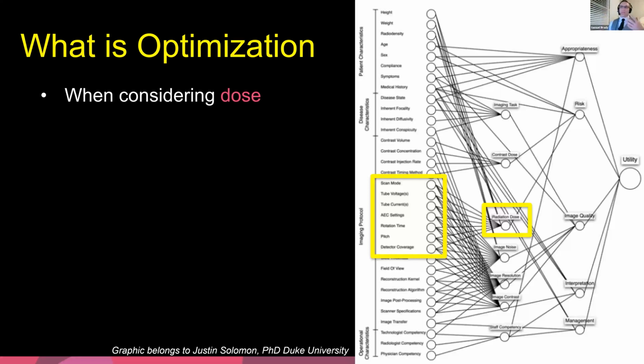So we had a lot of problems with our C spines for a long time. And the biggest fix, we tried everything. We tried kVs, we tried higher mAs, we tried everything. The biggest change was when we just started imaging from the bottom up, just because the system can reduce the dose from the shoulder to the neck really quick versus flipping it around. And so our biggest complaint from our radiologists was really C5 or C6 through C7. When you looked at it, the borders of the vertebrae were almost translucent and at times almost gone, just because of the noise content. And so anyway, that's my biggest suggestion.